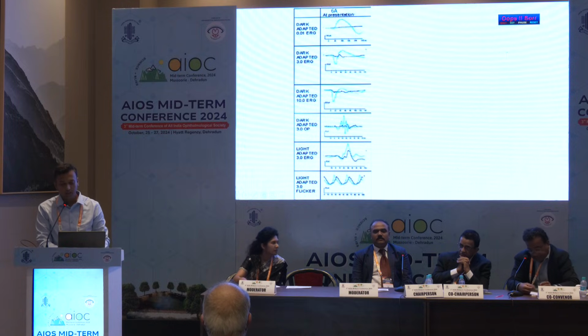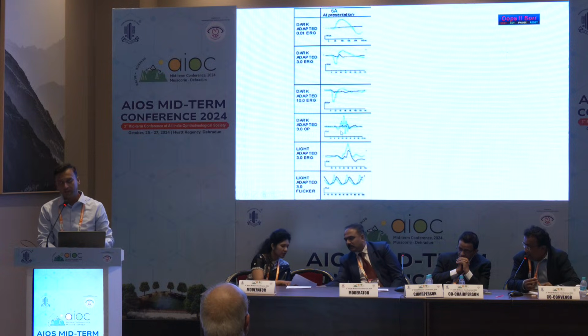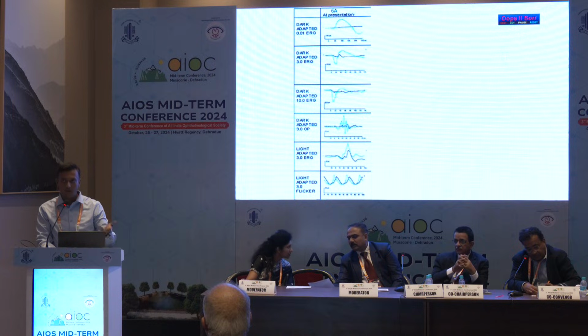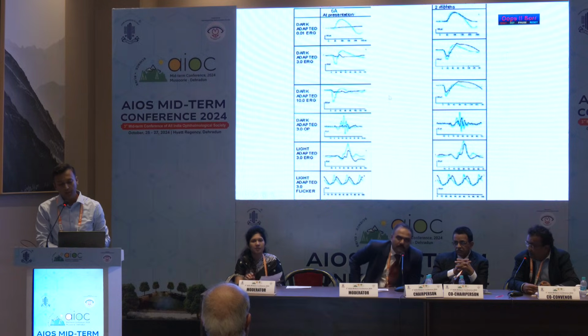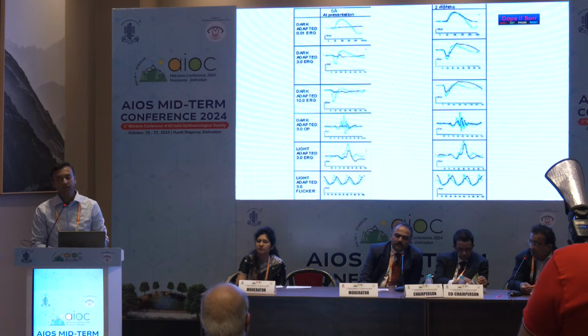Now if you see the ERG, this is how a normal ERG should look, the blue line, but we see straight lines in the dark adapted state. So this is a case of vitamin A deficiency, which is affecting his rod system. Treatment is simple. You just start vitamin A supplementation, and this is the repeat ERG after 2 months, and you see all the rod waveforms have picked up very beautifully. So this is how we can utilize ERG and EOG.